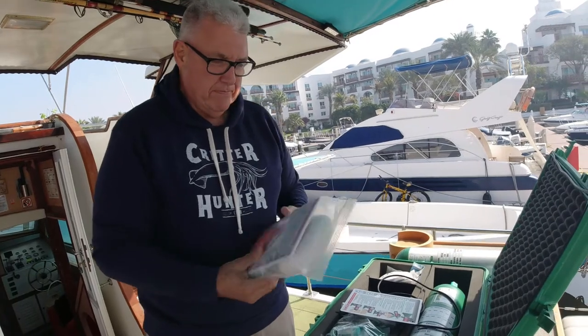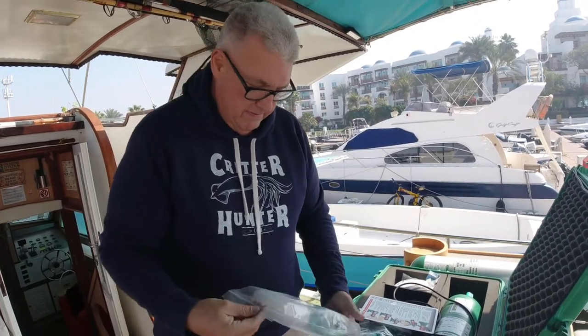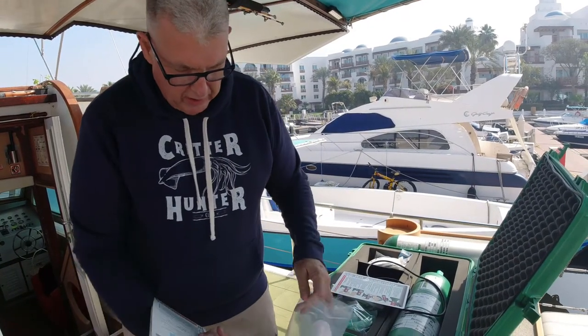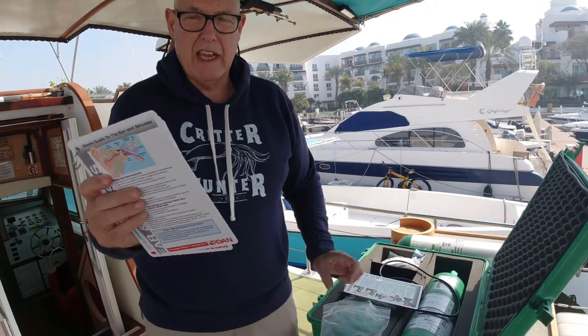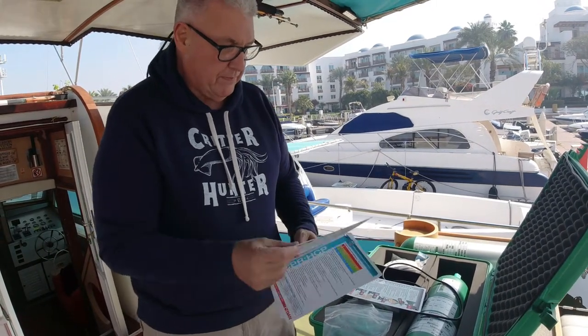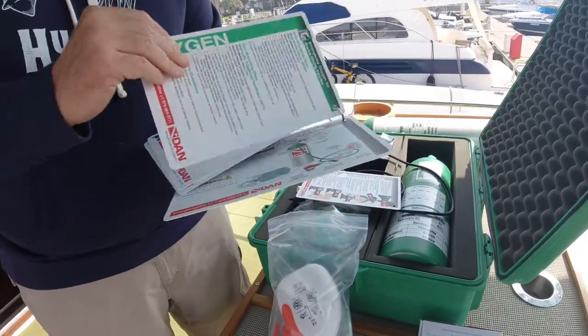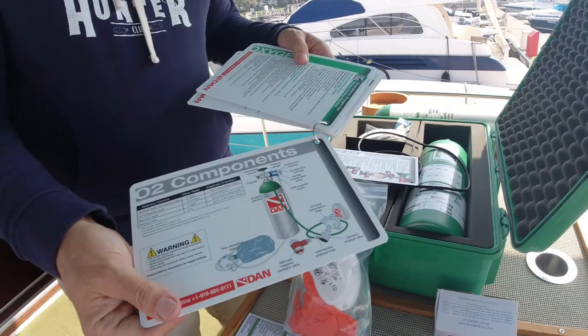This is another O2 service kit which comes with a full set of medical cards. I ordered one, getting an extra non-rebreather mask, an extra pocket mask, and the full set of DAN first aid cards which will go in our first aid kit. There's another O2 slate as well.